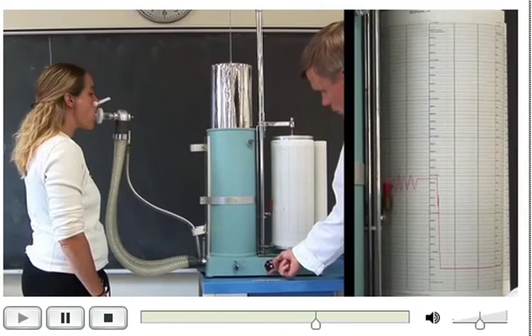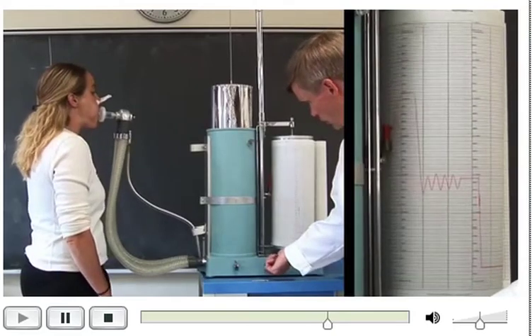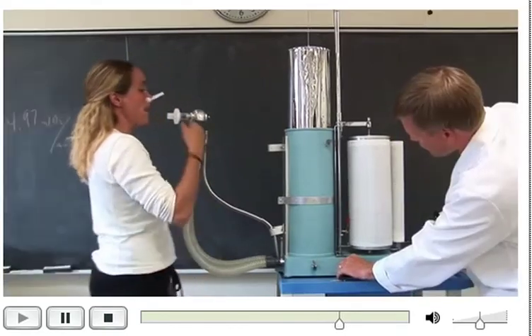Now one more. Now inhale all the way. Give it everything you got. Pause, blow it out, push as hard as you can, push it out, push, push, push, and come off.